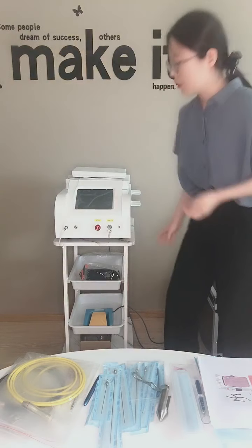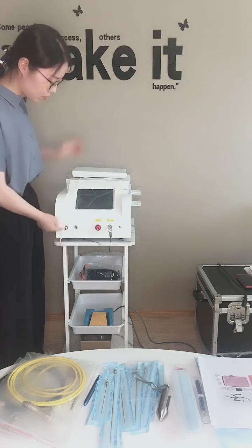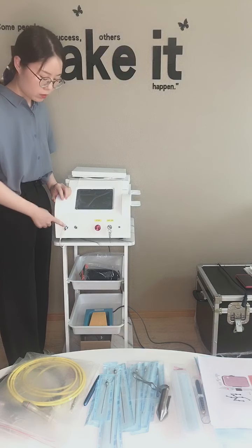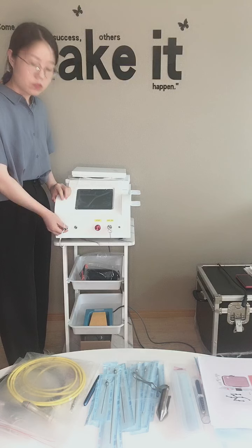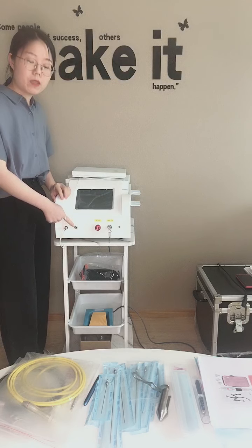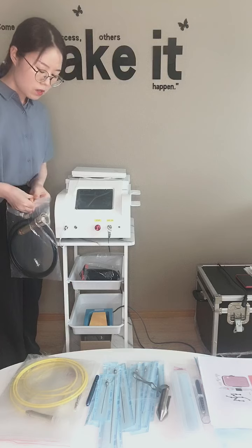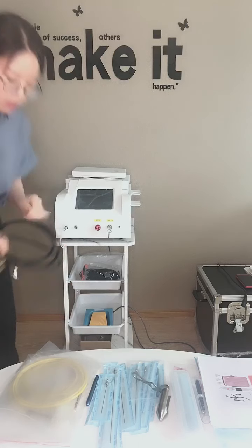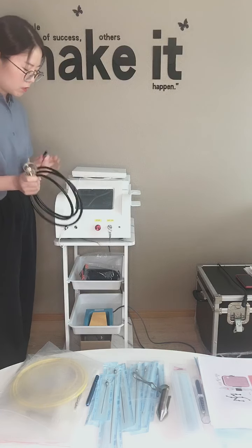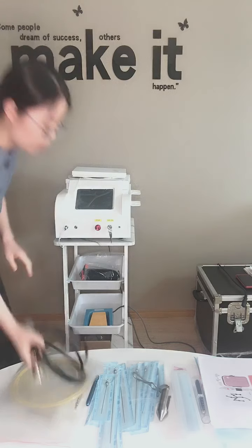Right now I will introduce the connectors one by one. Here, this is the connector between the handpiece fibers and the laser machine. This is very important, so please make it clear, and do not attach it with the hand when you remove the protective caps. This is only for the physical therapy handpiece, because only the physical therapy handpiece has the control button, and this is the power for the control button.